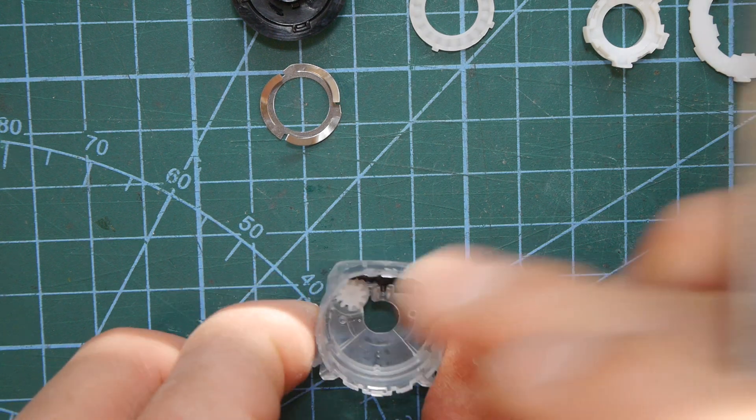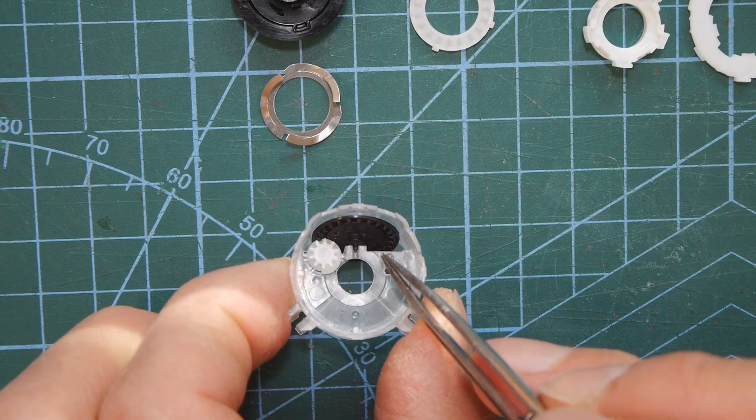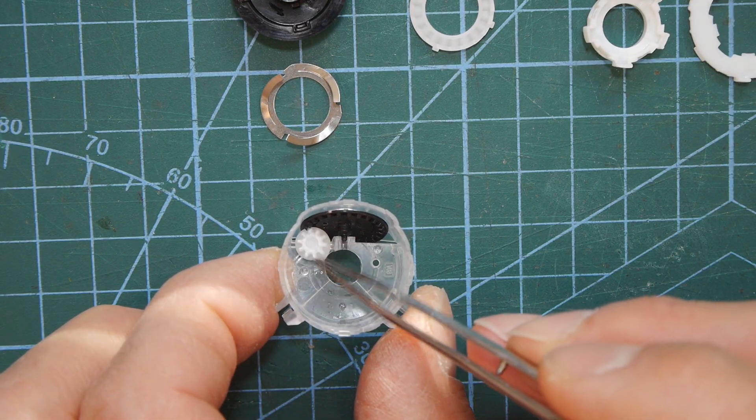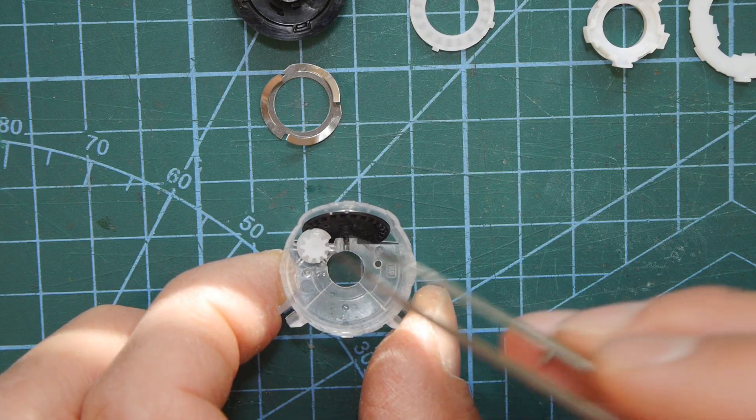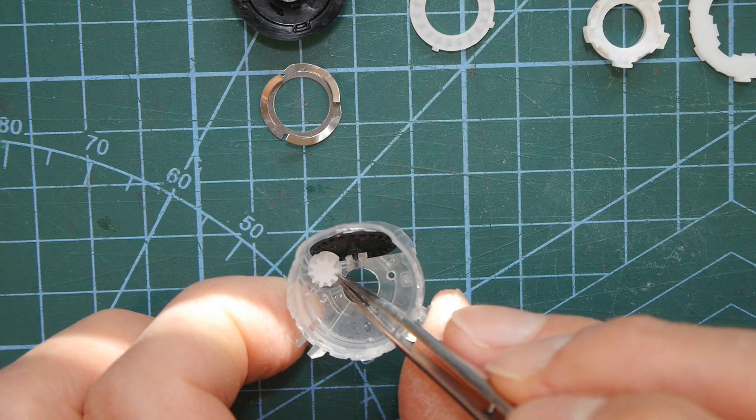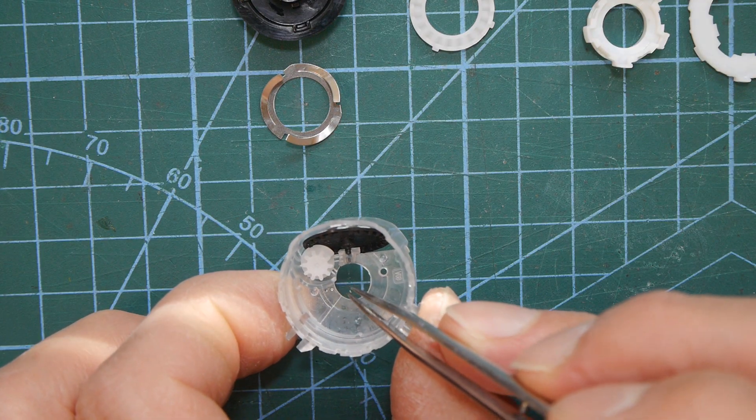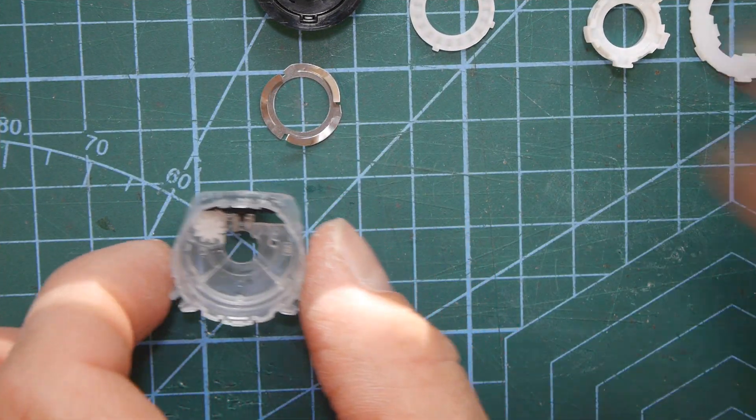So you're now aware that to turn the dial that does the counting you need to connect to this little gear here and rotate that, and that will rotate the worm drive that drives the counter wheel. But how do we rotate this little gear? So I'll show you how that works now.